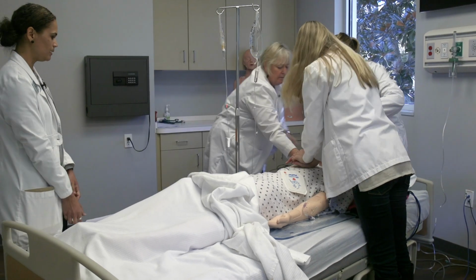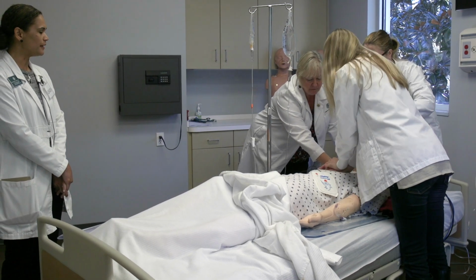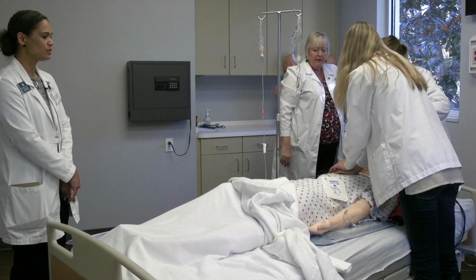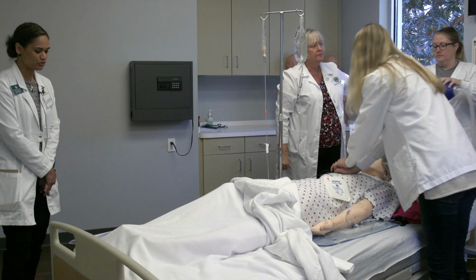12, 13, 14, 15, 16, 17, 18, 19, 21, 22, 23, 24, 25, 26, 27, 28, 29, 30. If we could get the machine to defibrillate, please. We're going to defibrillate at 200 joules. Charging. 200. All clear. I'm clear, you're clear, we're all clear. Everyone clear? Charge delivered. So resume CPR.